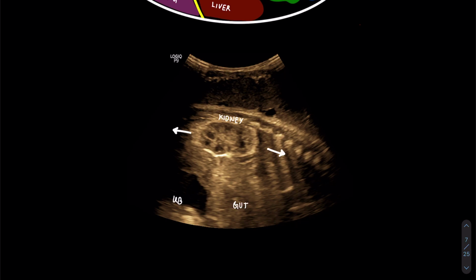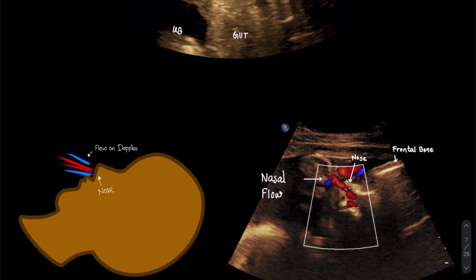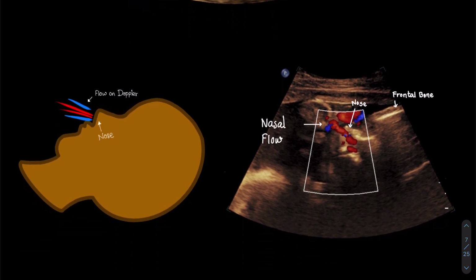Long video session. My plan was to make your eyes accustomed with breathing movements. It's easy but commonly mistaken.